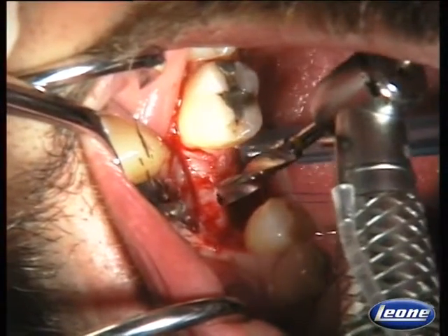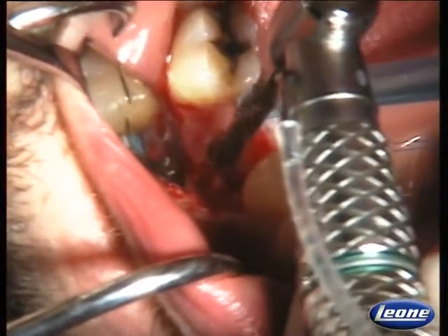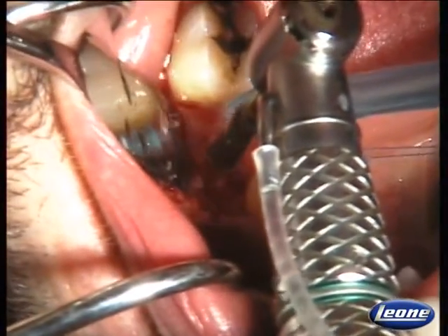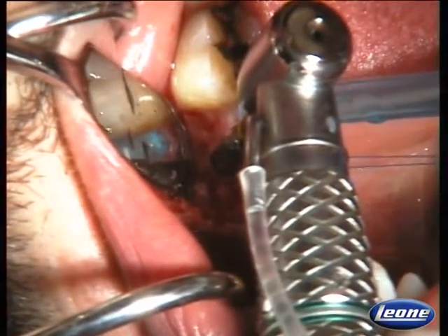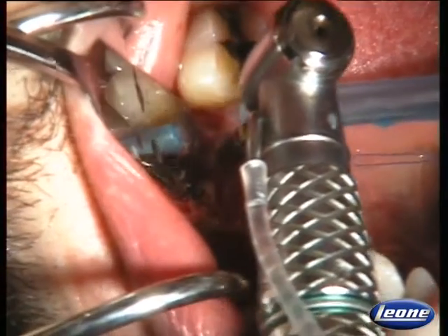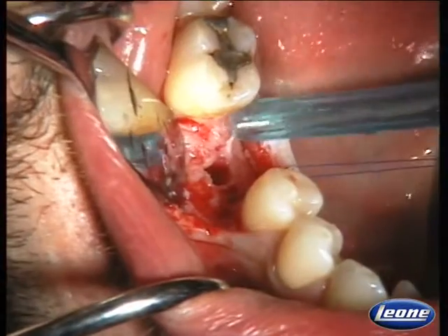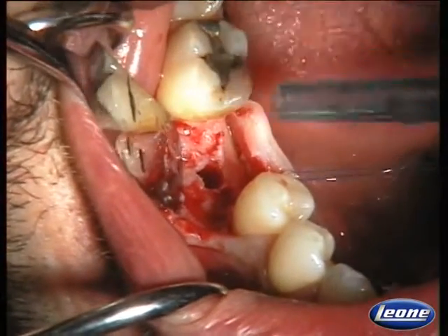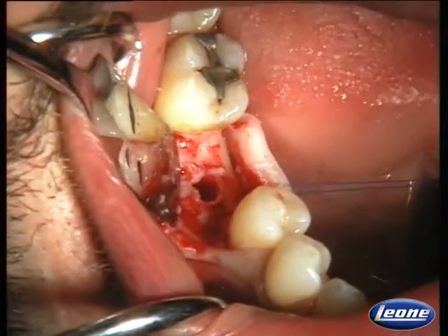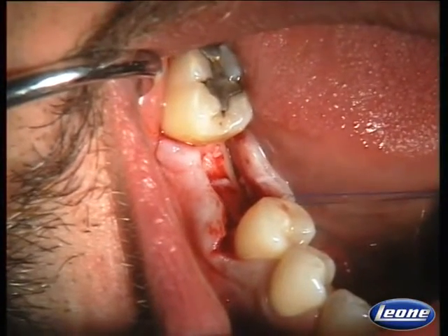This is the twist drill for a 4.1 implant. We start drilling 6.5, 8, 10, 12, and 14. At this point, the implant site for the 4.1 implant is already prepared. We are only missing the preparation of the coronal portion for the flared implant neck.